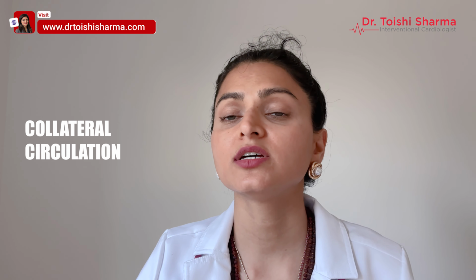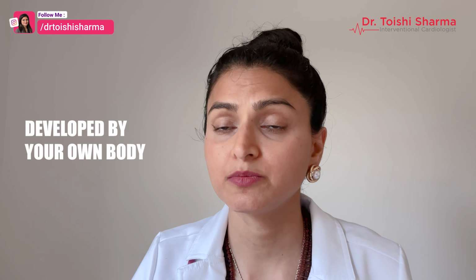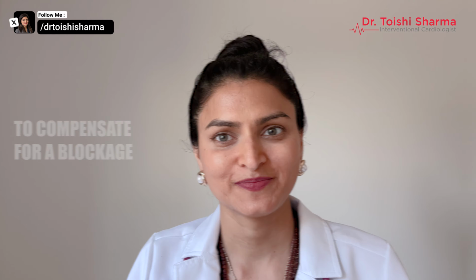Lastly, you can also see something like collateral circulation. What this is, if there is a blockage in one of the blood vessels, the collateral blood vessels are natural bypass vessels that have developed by your own body to compensate for a blockage. So friends, these particular details put together help your cardiologist to decide the best treatment plan for you.